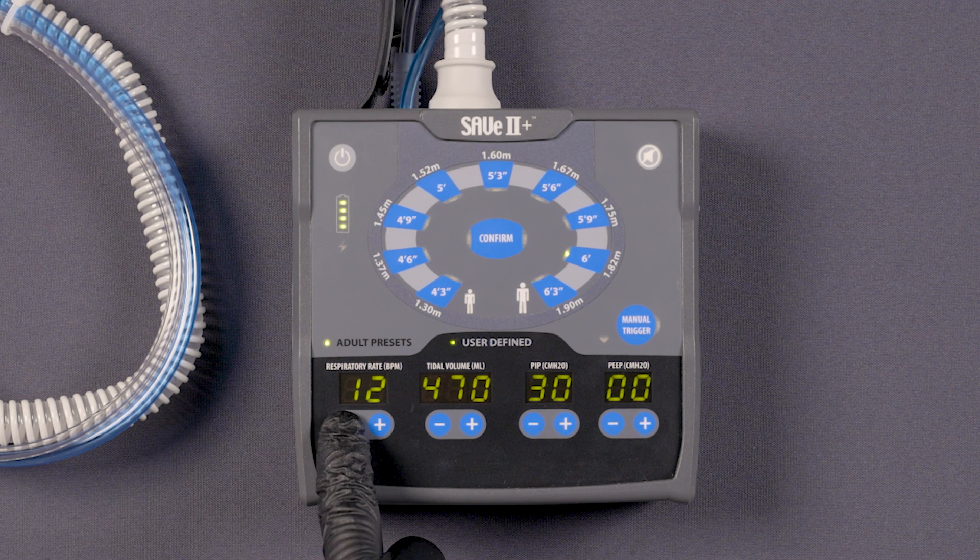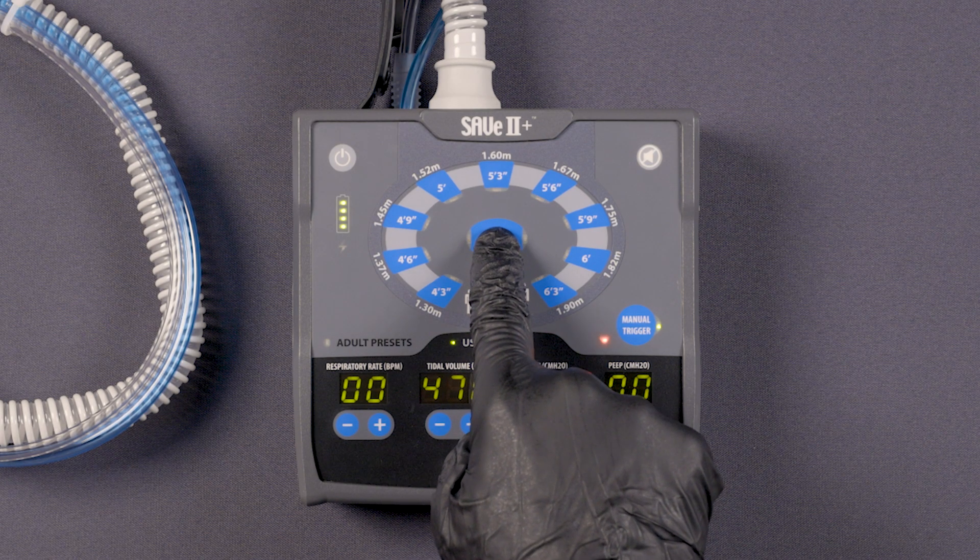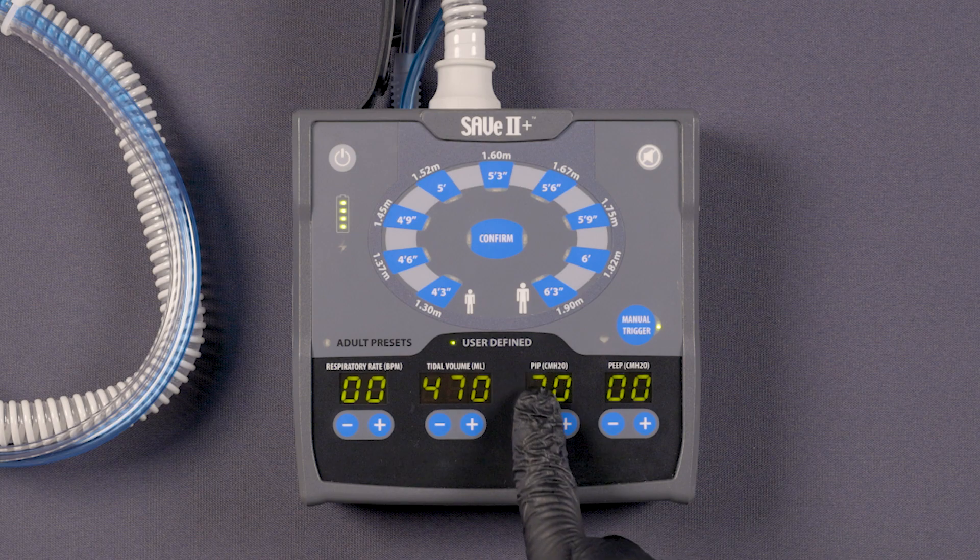reduce the respiratory rate to 0 using the minus buttons under the respiratory rate on the ventilator interface, and continue to press until the rate reads 0. Then, initiate this change by pressing the confirm button.